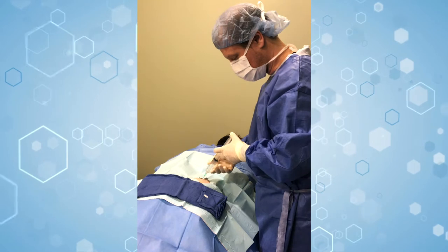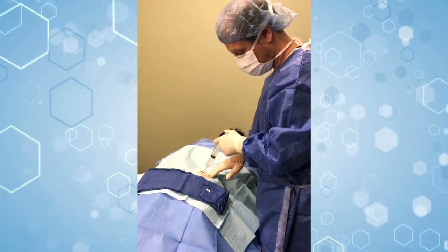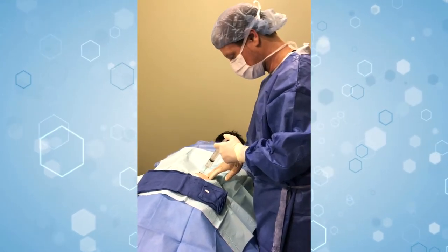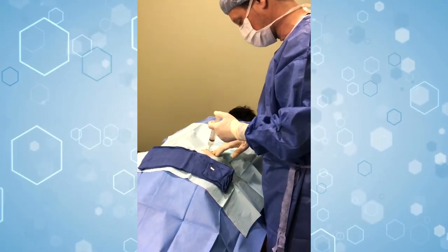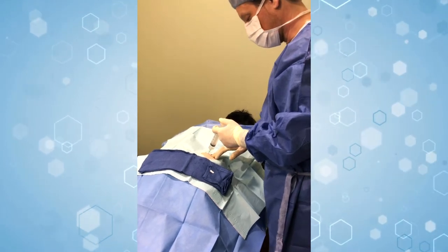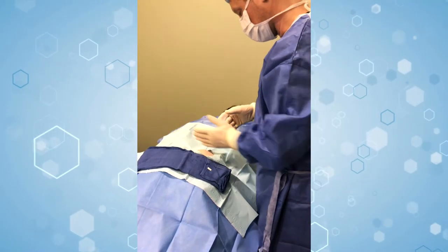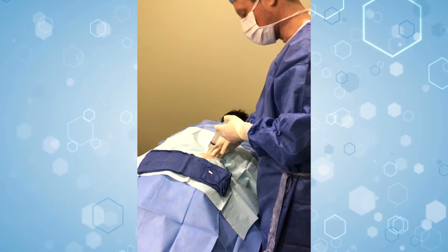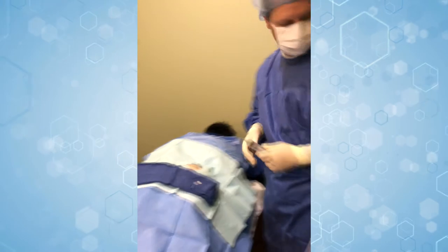This also helps us set our angle when we start using the trocar. Right here's a good angle. Our two landmarks that we don't want to hit: one would be the sciatic notch because the sciatic nerve runs there, so we have a mark placed down there. And then the other one is going to be the iliac crest, which would be up here, because that would slip off the pelvis — so we don't need to be up there. And that's all the numbing that we need.